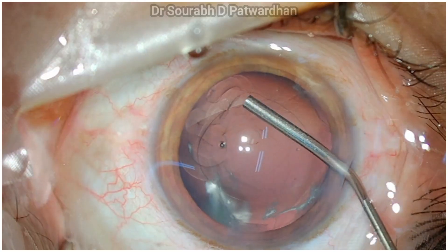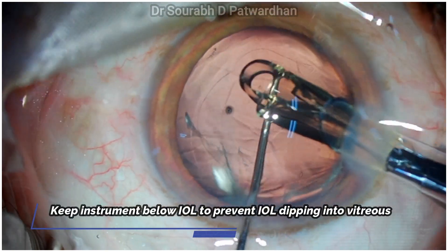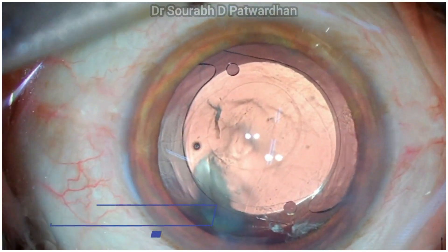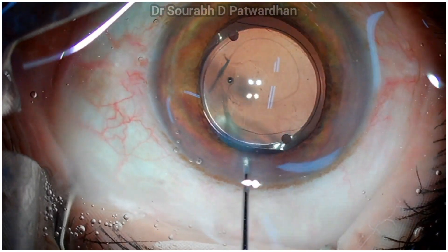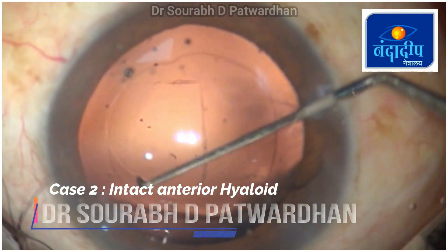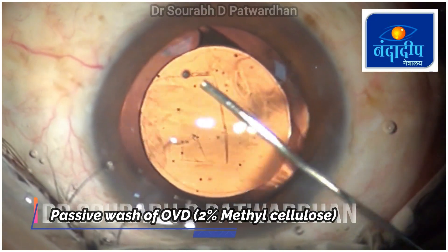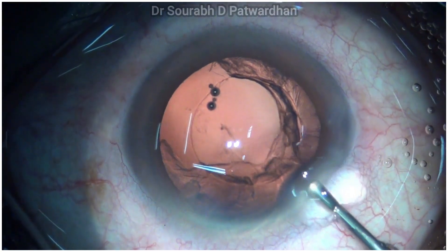While placing the IOL in the bag, keep the Sinskey below the IOL so it doesn't open directly into the bag; open it in the anterior chamber first and then gently nudge the IOL into the bag. Once the IOL is in the bag, use diluted triamcinolone to confirm no vitreous is present before closing. If the PC tear cannot be converted to PCCC but the anterior hyaloid is intact and there is no vitreous, you can still place the IOL in the bag — but use gentle cannula flushing rather than high-flow irrigation to wash remaining viscoelastic, which avoids sudden deepening of the anterior chamber and enlargement of the PC tear. To detect whether the anterior hyaloid is intact: after injecting OVD, if no viscoelastic goes into the vitreous cavity, the anterior hyaloid is intact.